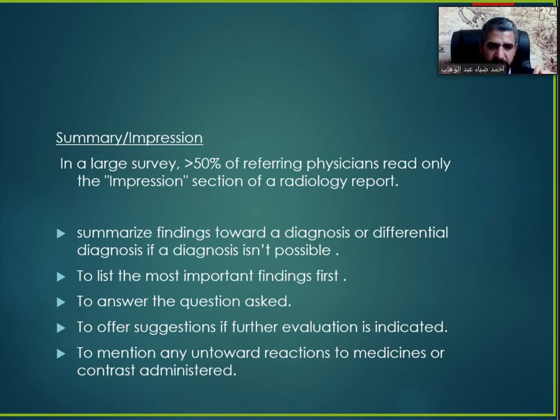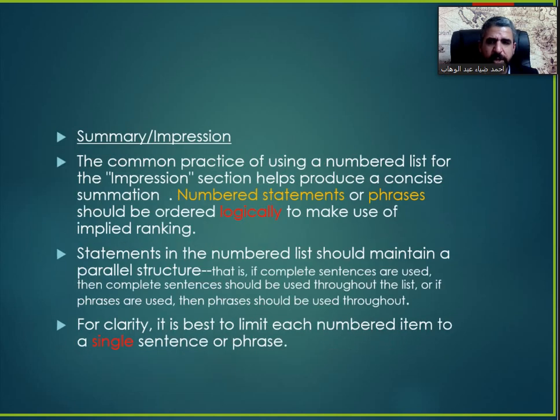And we need to offer suggestions if further evaluation is indicated, what kind of further evaluation, and to mention any adverse reaction to medicines or contrast administration. We should mention the patient had an adverse reaction to contrast, so that in the future we are careful with these kinds of reactions. Also in the summary or impression, the common practice of using a numbered list for the impression section helps to produce a concise summation.